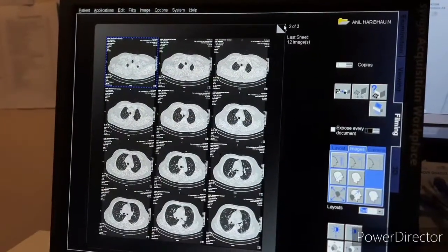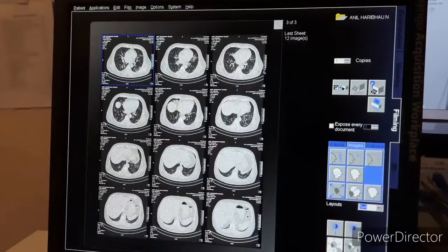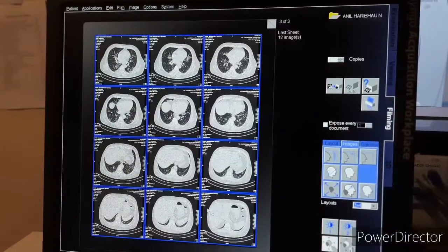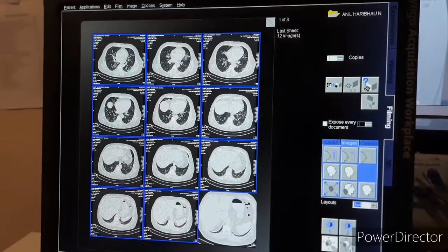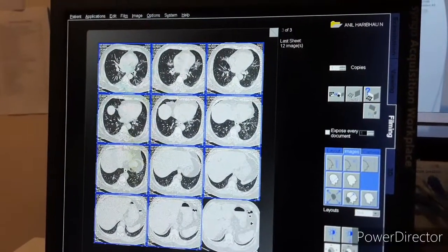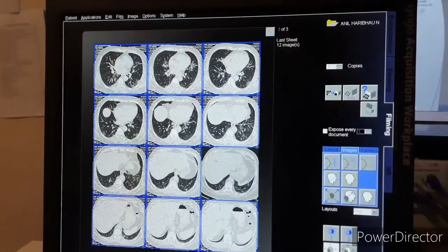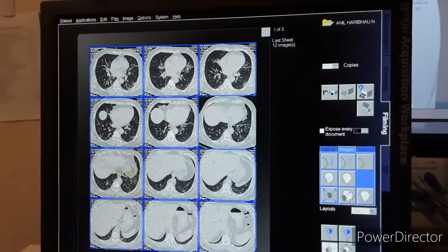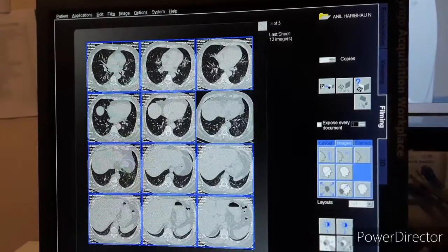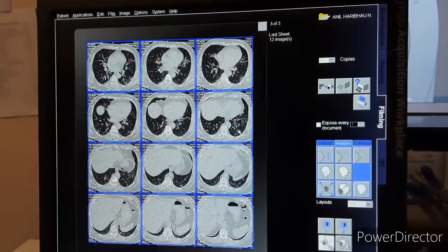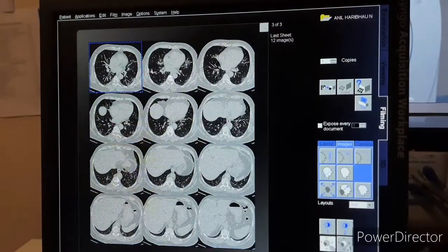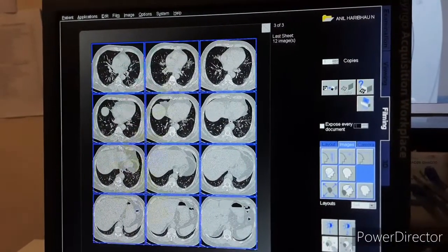And this is for lung window — 3x4 format. We are giving 3 films for lung window.